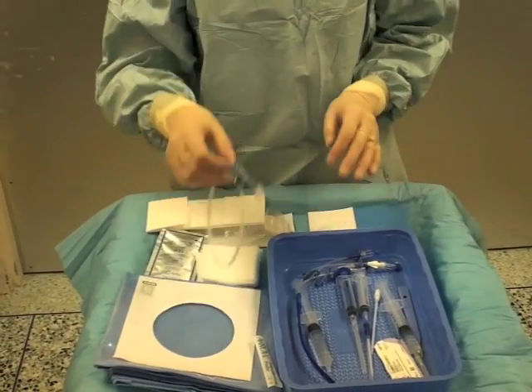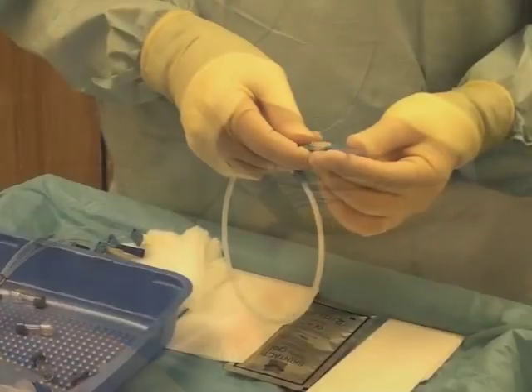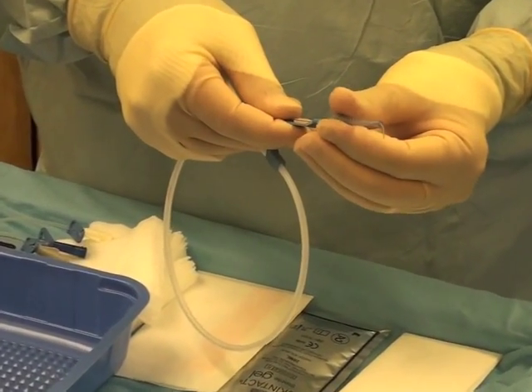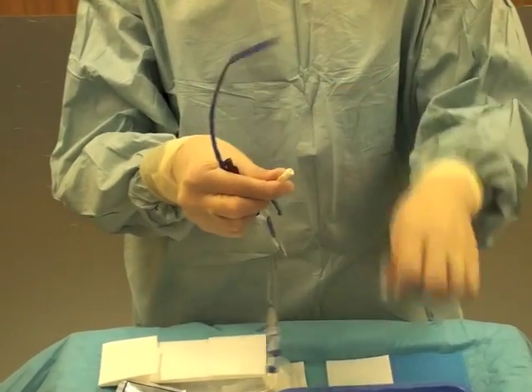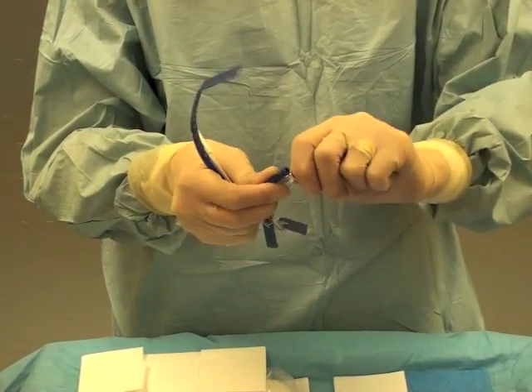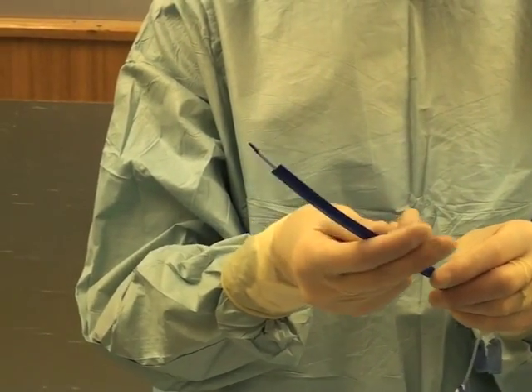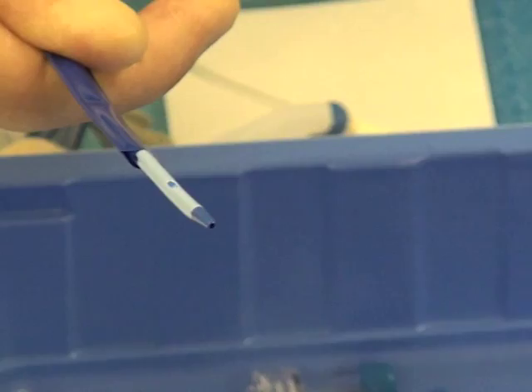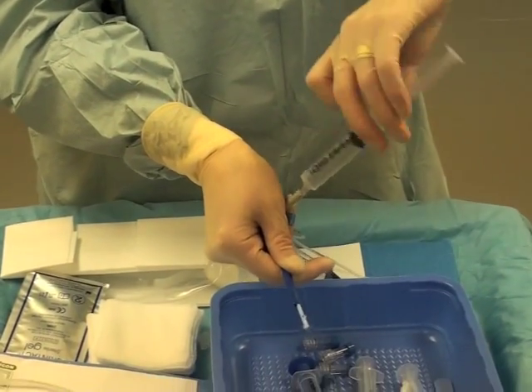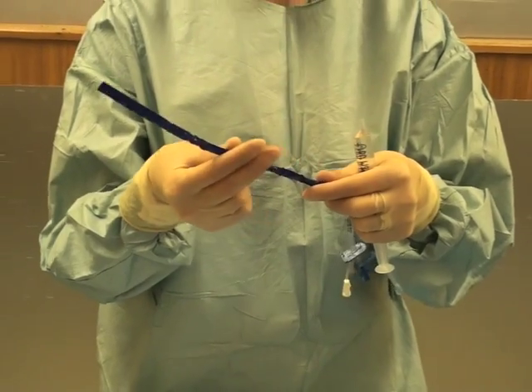Now that everything is at hand, check your guide wire — remove the cap protection and make sure it is easy to withdraw. Then check the catheter, avoiding touching the tip. Remove all caps and, using normal saline, flush all the ports and watch for saline coming through the holes at the end of the catheter. Once all ports are flushed, clamp all ports except for the longer lumen — the brown end — which is the port through which the guide wire will come out.